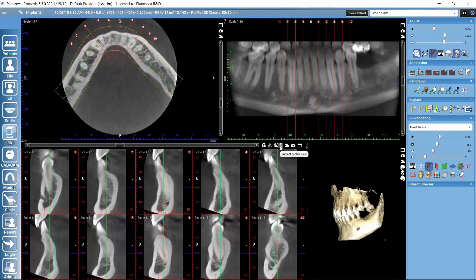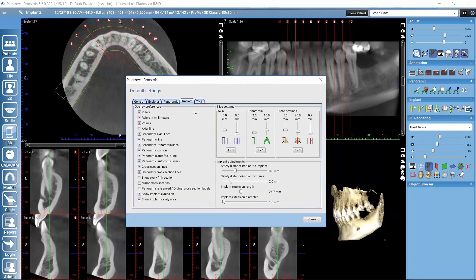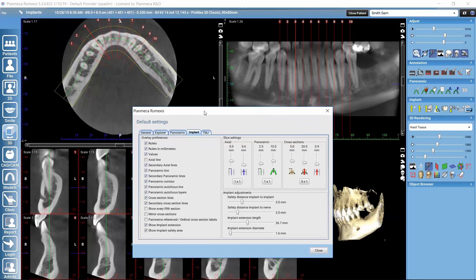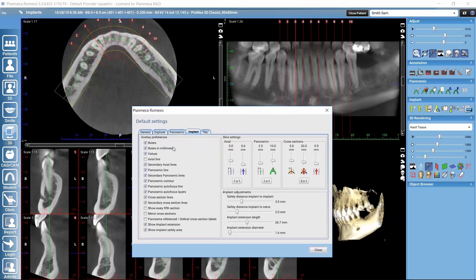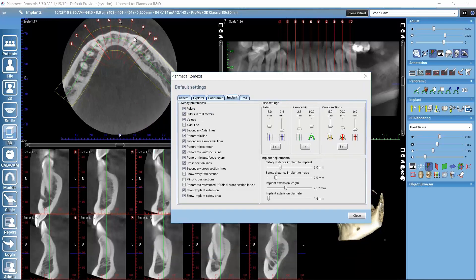Let's look at the default settings using this wrench-like icon on the toolbar. In a familiar way, we can hide different overlays on these views — for example, I could hide the secondary cross-sectional slices on the view. I can also change the numbering for these cross-sectional slices: by default they use ordinal numbering, but I can switch to panorama reference numbering instead.